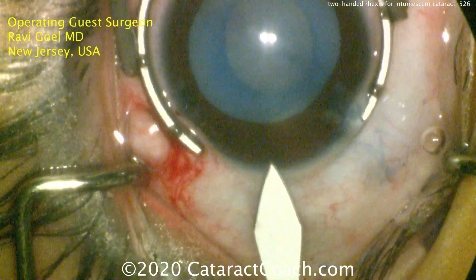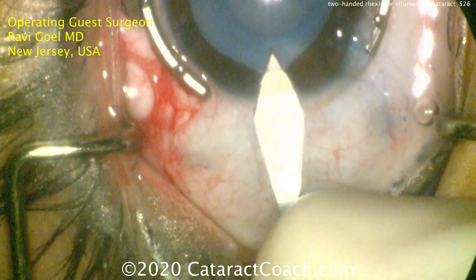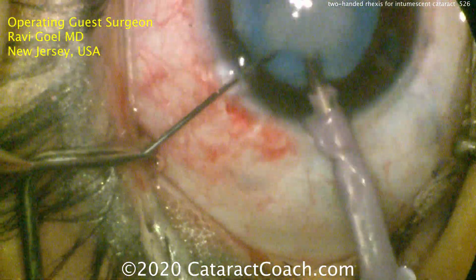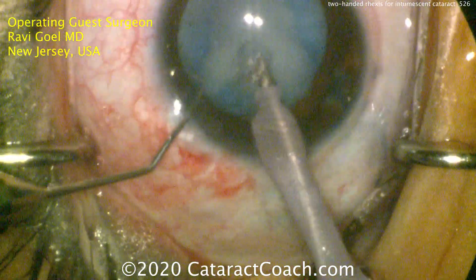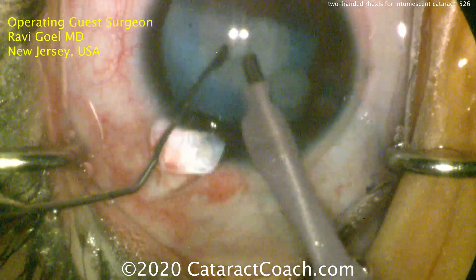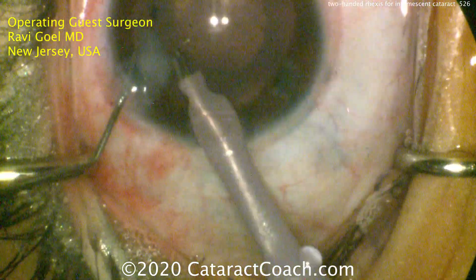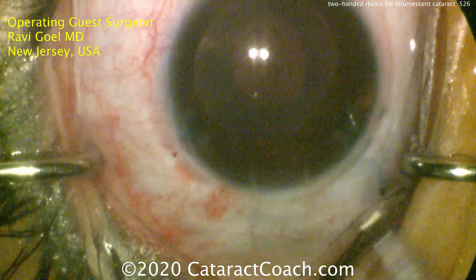Now making the main incision. You can see that rhexis looks fantastic. When the main incision is made, you're going to start to get egress of that intumescent fluid because now we're going to lower the pressure in the anterior chamber. There you see the fluid egressing. Putting the phaco probe in the eye — this is all just vacuum. There's really no lens density here, no nuclear sclerotic changes. Just simple vacuum. And look, just in a matter of seconds, the entire lens is quickly vacuumed out of the eye.